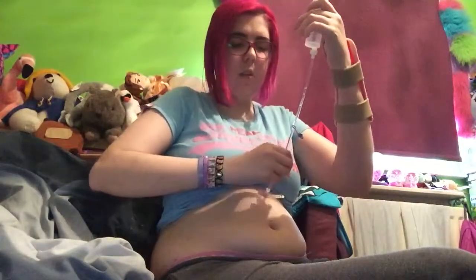And if it's not moving, just a little simple push with your hand, like so, and now it is flowing. People do ask if you can feel it, and you can't really feel it. It depends how cold the water is, or how cold the medication is, or how cold the feed is. Sometimes you will feel a little cold sensation, but not as much as an NG tube. So that is it gone, and you just clamp it again.